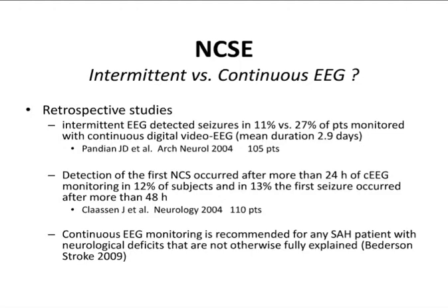And also a word of caution is that you do not want to use generalized anti-epileptic prophylaxis in these patients. There have been studies showing an association between generalized anti-epileptic prophylaxis and actually worse cognitive outcome. So what we do recommend is that if you have these patients and you have clinical suspicion, at least perform EEG monitoring. In some centers, they perform continuous EEG monitoring for the first 48 hours.